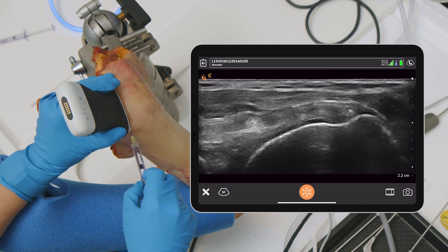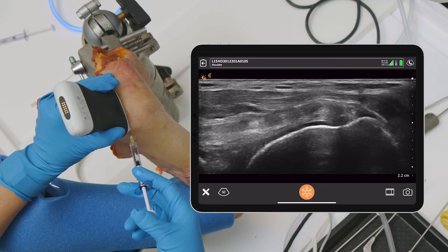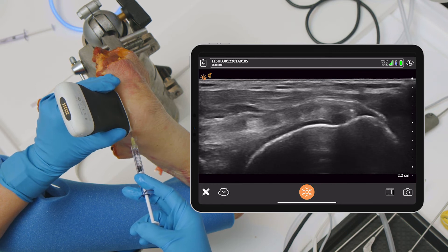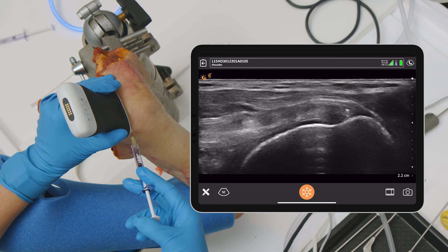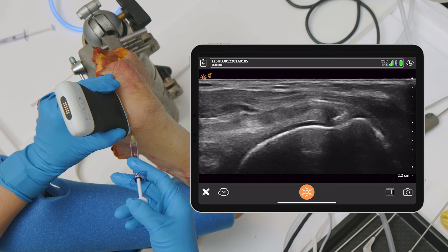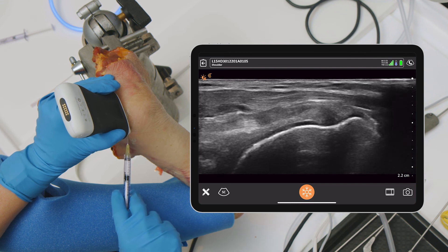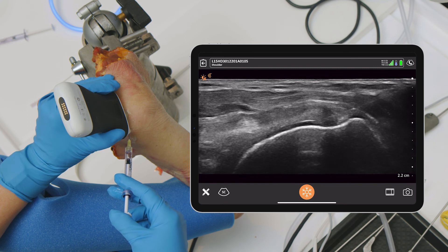If you're doing an injection, I'll do a little puff of fluid in there — I don't want to do too much — but you can see I'm actually in the joint, you can see it flowing into the joint. This is not an ideal area to do intra-articular injections, but it is possible. It just gives a little more chance you're going to hit the cartilage. My needle is probably in the articular cartilage, intra-articular, right now. That's why typically when we're doing a PRP, we want to get to the actual insertion site right there — that would be the better spot. So: subacromial, intra-articular, or into the rotator cuff supraspinatus tendon right there — and that's how we do those shots.